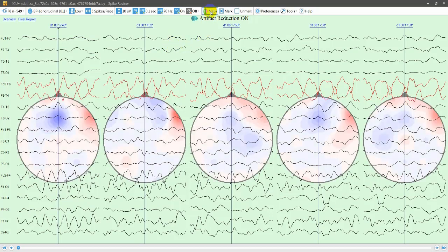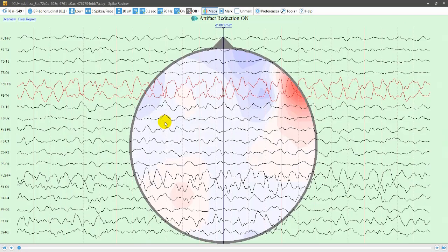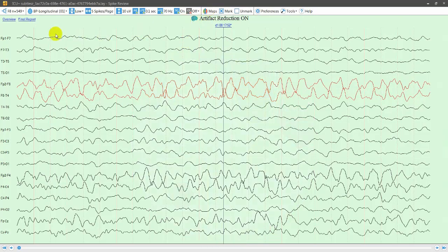Last but not least, you can turn the voltage map on and the system will calculate the voltage map for each displayed detection. You can then decide to expand the spike in order to better review the result, and click on Maps again to turn it off, then go back to the Persyst workspace.